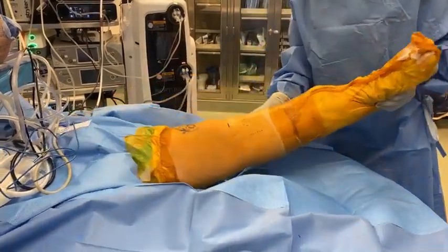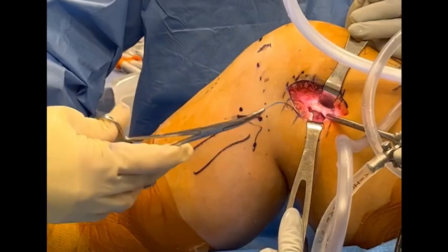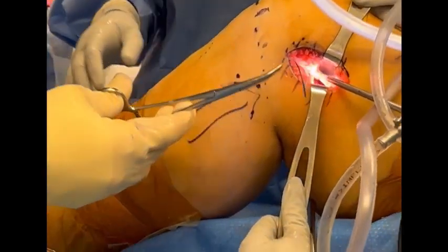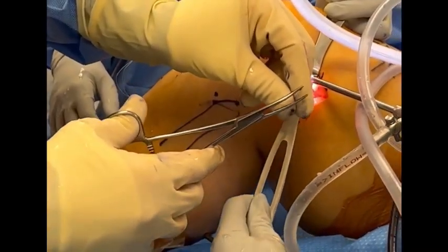To begin, a 1.5-inch posterolateral incision is made proximal to the lateral epicondyle, centered over the posterior IT band. A suture is passed with a curved Kelly through the notch, and the lateral wall of the lateral condyle is decorticated for the over-the-top graft location.